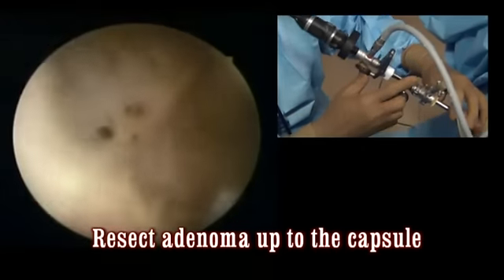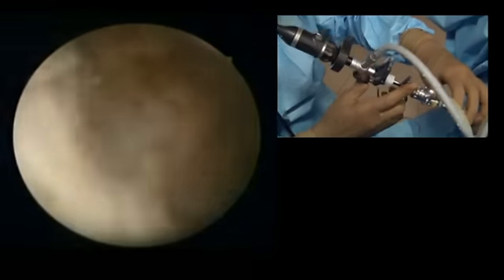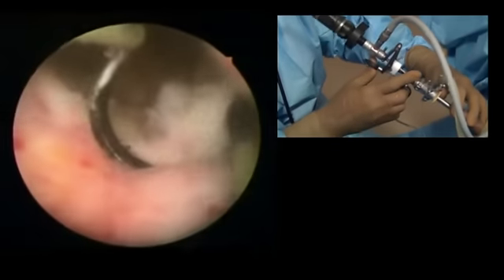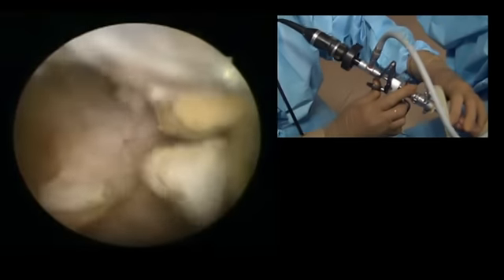You will appreciate that I am taking thin chips. This black tissue that is coming is corpora amylacia. If needed, you can also make a retrograde cut, though with a retrograde cut the chips get interrupted.